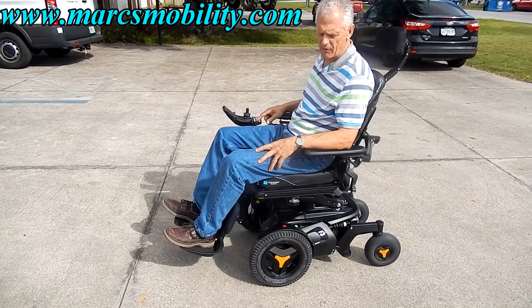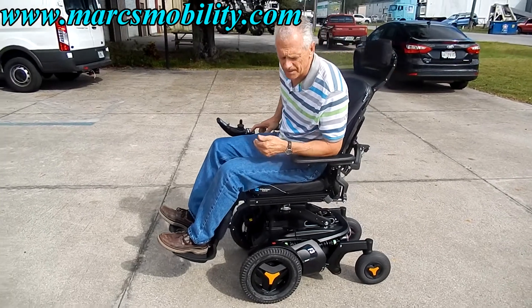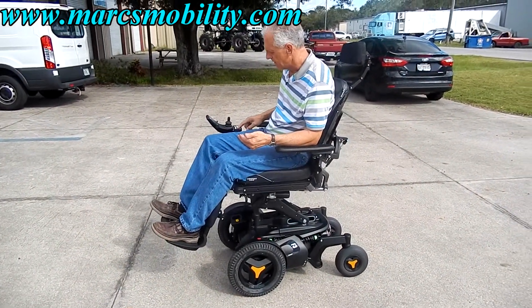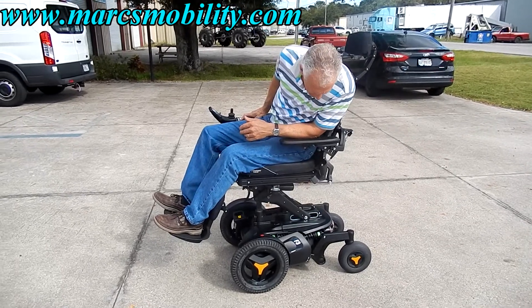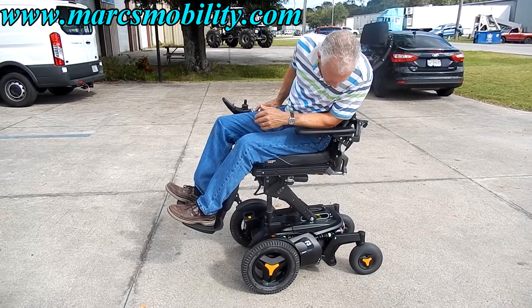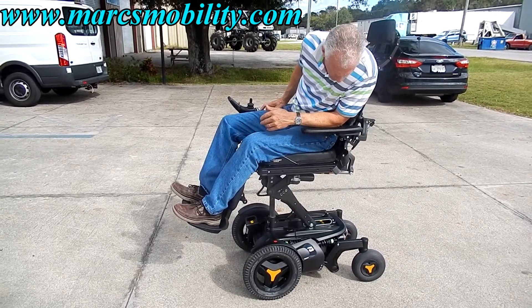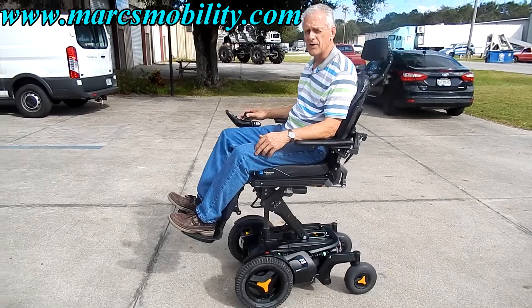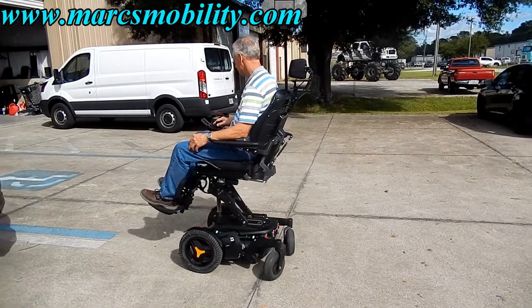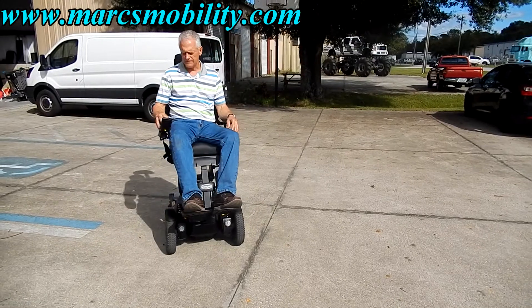This chair goes 5 miles an hour. I'm raising the seat up right now — I forgot to mention in the video that you can drive this chair with the seat elevated. So when the seat is elevated, you can still drive this chair, just at a lower speed.